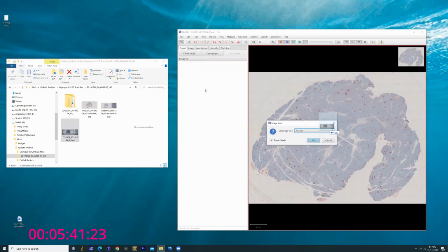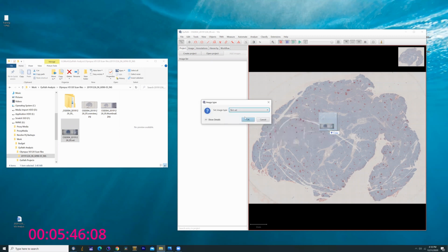Now, while it is possible to do it this way, I'm actually going to show you another process. It's actually a better process utilizing projects. But I think I'm going to cover that in the next section.